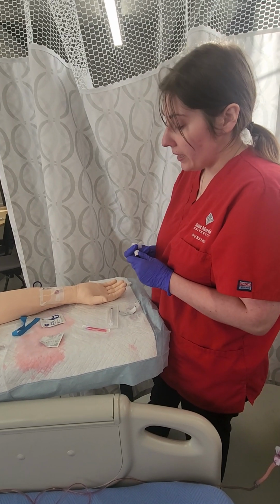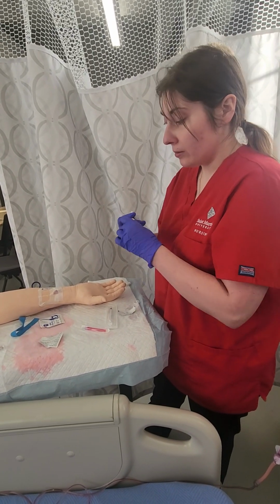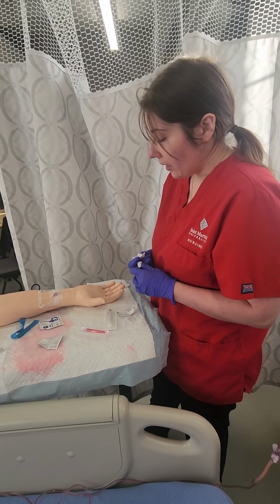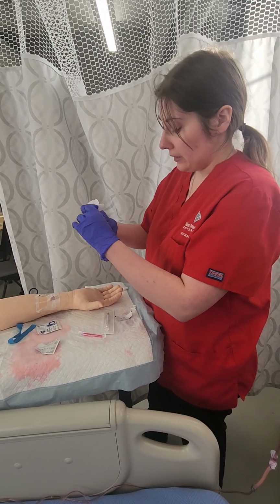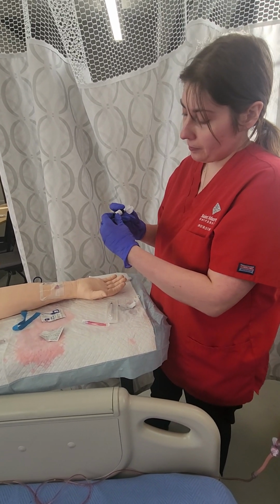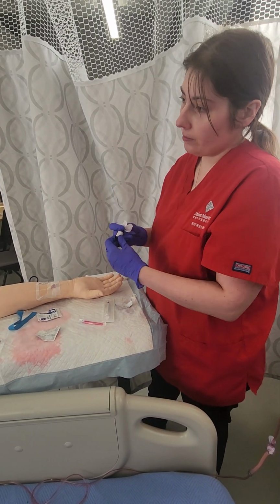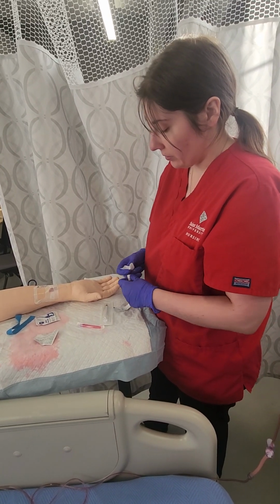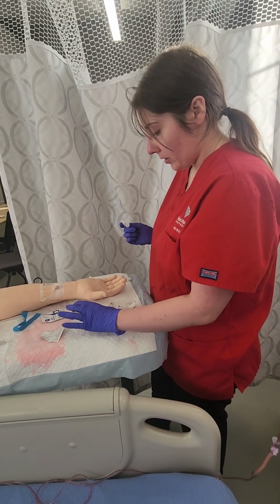For his pain, 6 out of 10, the right reason. He hasn't had it in a while, so it's the right time. This is the right route. It's IV solution, so we're good there.